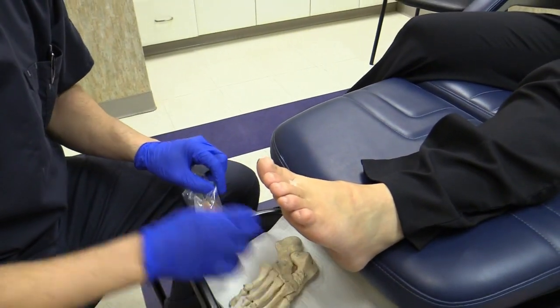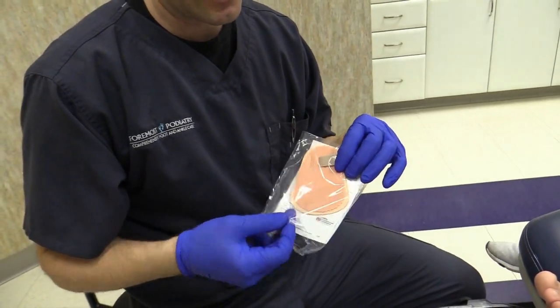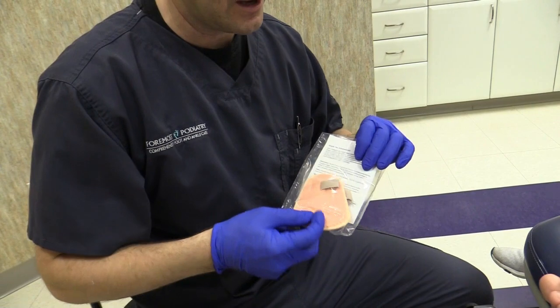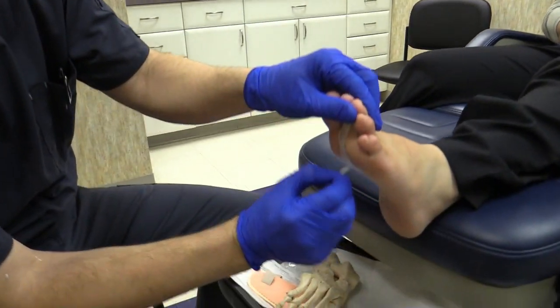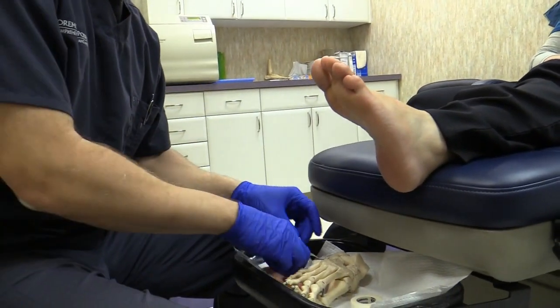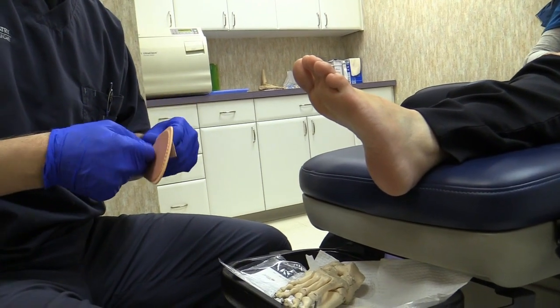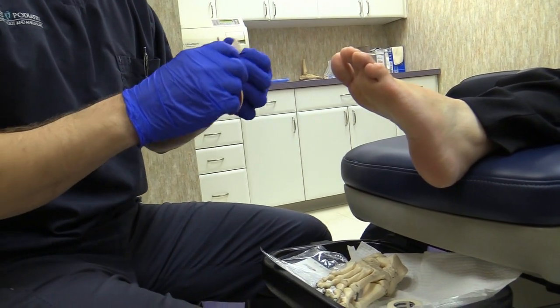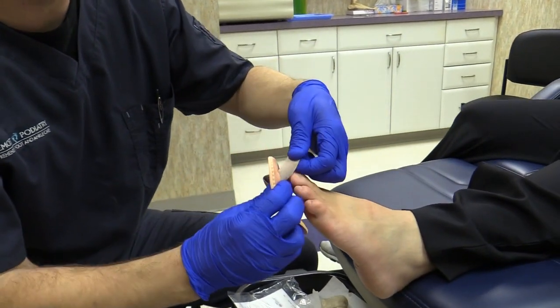We have a splint. This is called a Budin toe splint. We carry these here; you can also find them online or at different pharmacies. The splint is easier to use, but the downside is you can't really control the tension as well. The splint only works while you're walking or standing, whereas the tape can work 24 hours a day.